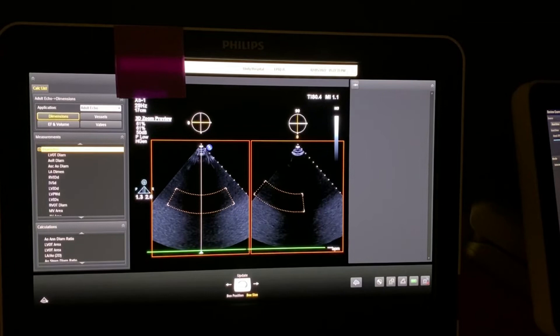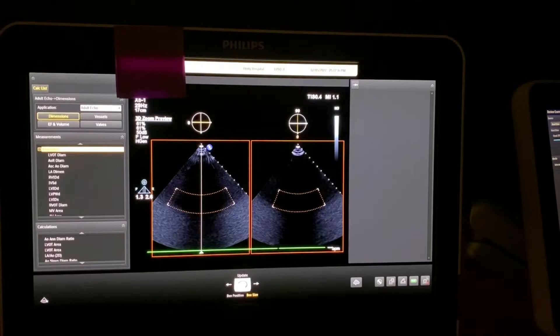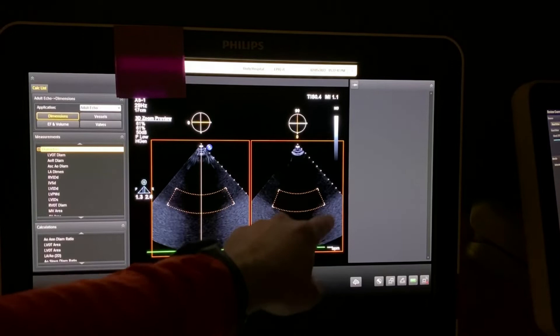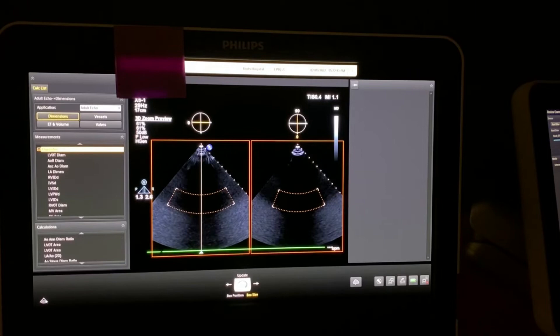The knob next to it is called the elevation position knob, so it allows me to swing back and forth. It's very useful when acquiring the surgeon's view where you need to see some of the LVOT into the aortic valve. So that when you capture your 3D view, you can put the aorta at the top at 12 o'clock and you can have your surgeon's view.